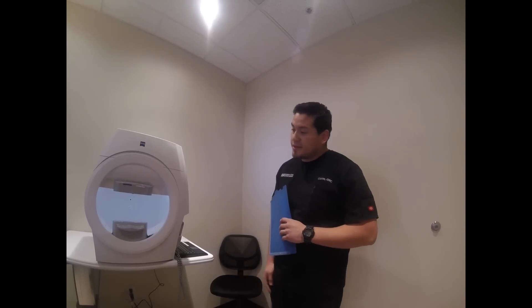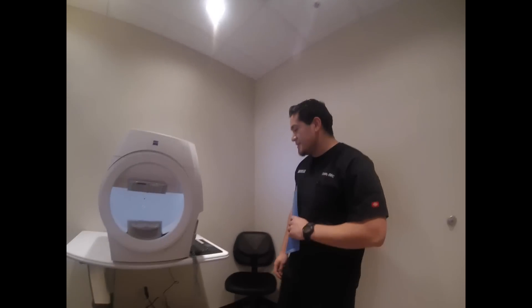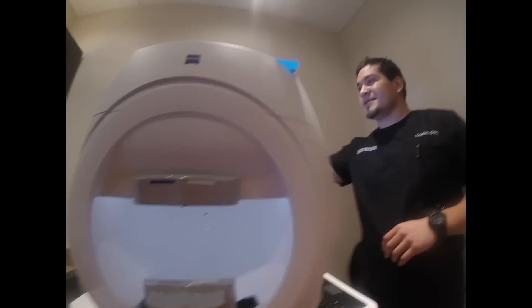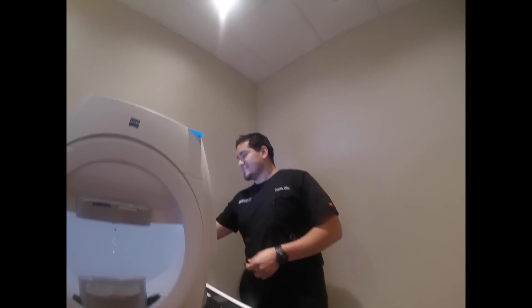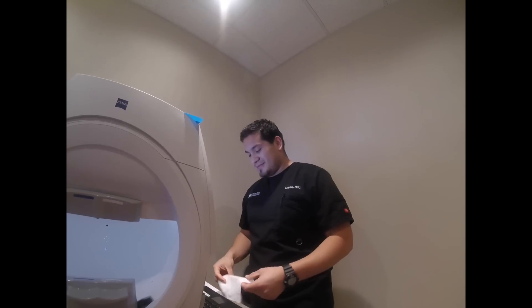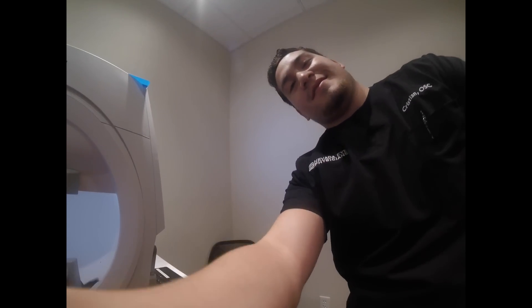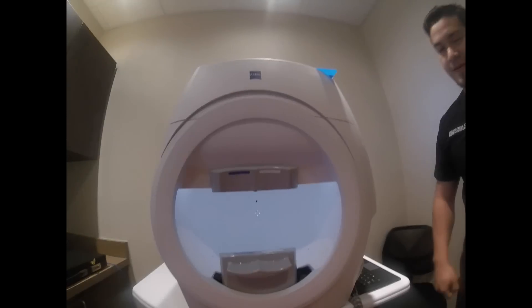What we want to see with this is that glaucoma can affect your visual field, so your field of vision — we want to see if there's any defects or if there's anything else going on with it. So mostly you're going to be clicking a button the whole time and seeing a lot of dots. I'm going to put an eye patch over your eye. Good.